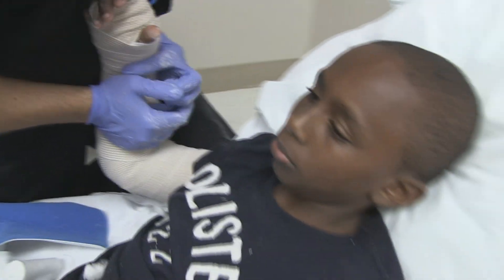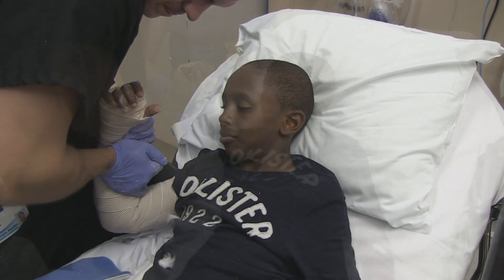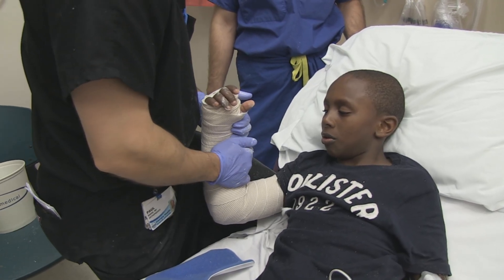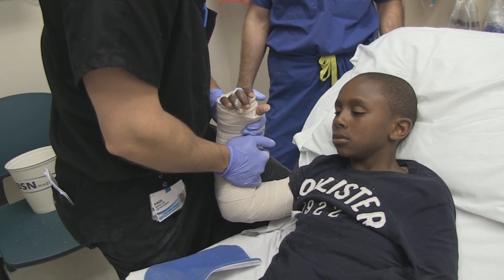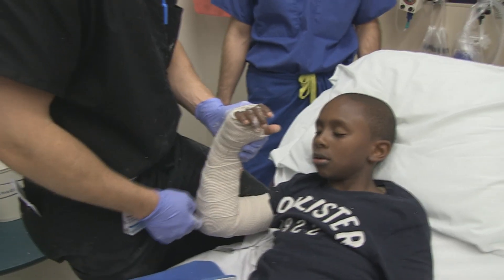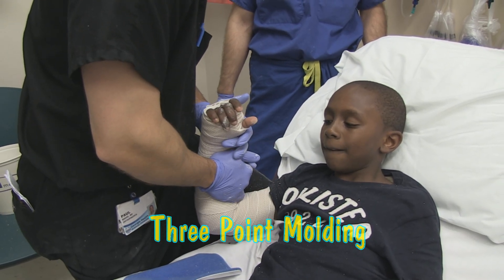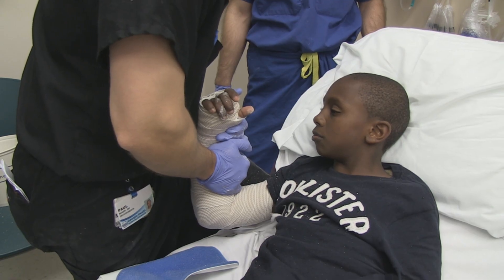So while he's molding that — what's your goal on the molding? It's just a three-point mold, standard mold for a radius fracture. It helps prevent the deformity. His is off dorsally, so you get a nice curve to the mold. I have my leg as one point, this is the other one proximal to the fracture, and the other one is distal to the fracture — sandwich everything between. Use the palms of your hands, not the fingers. Hold it until it dries.